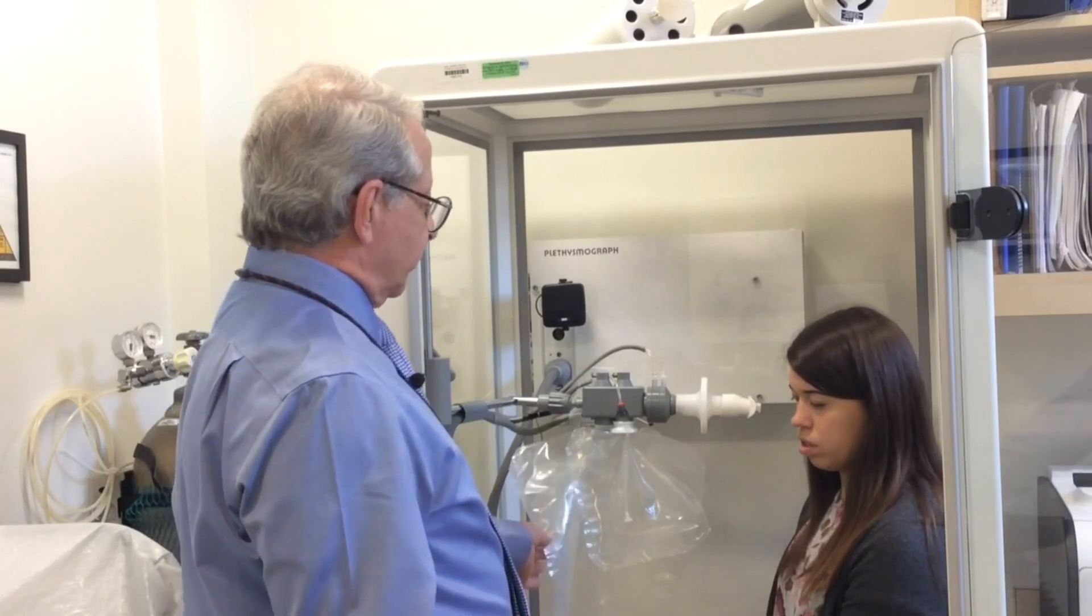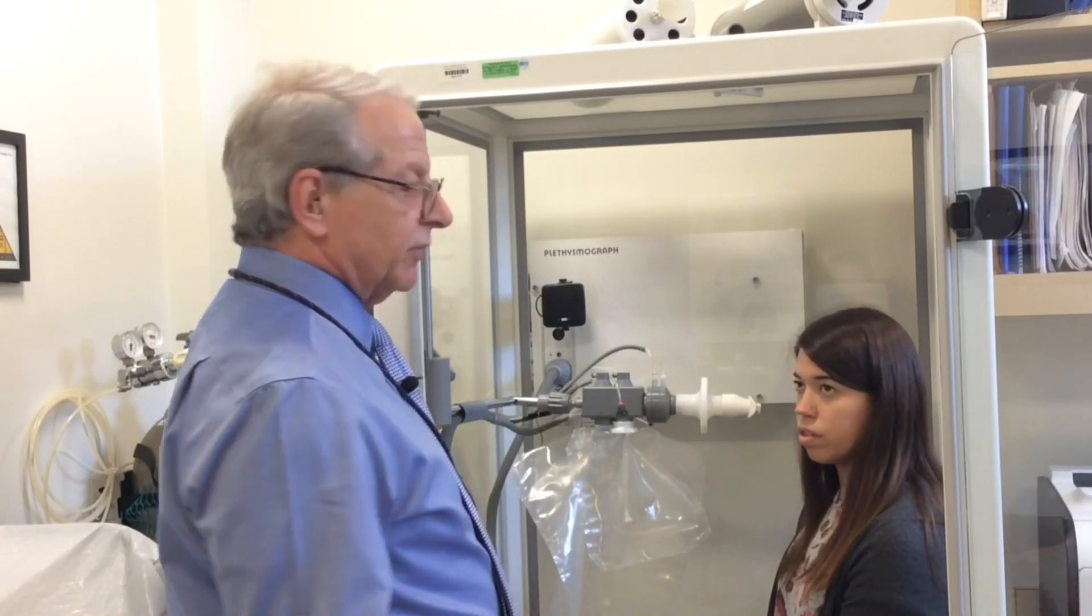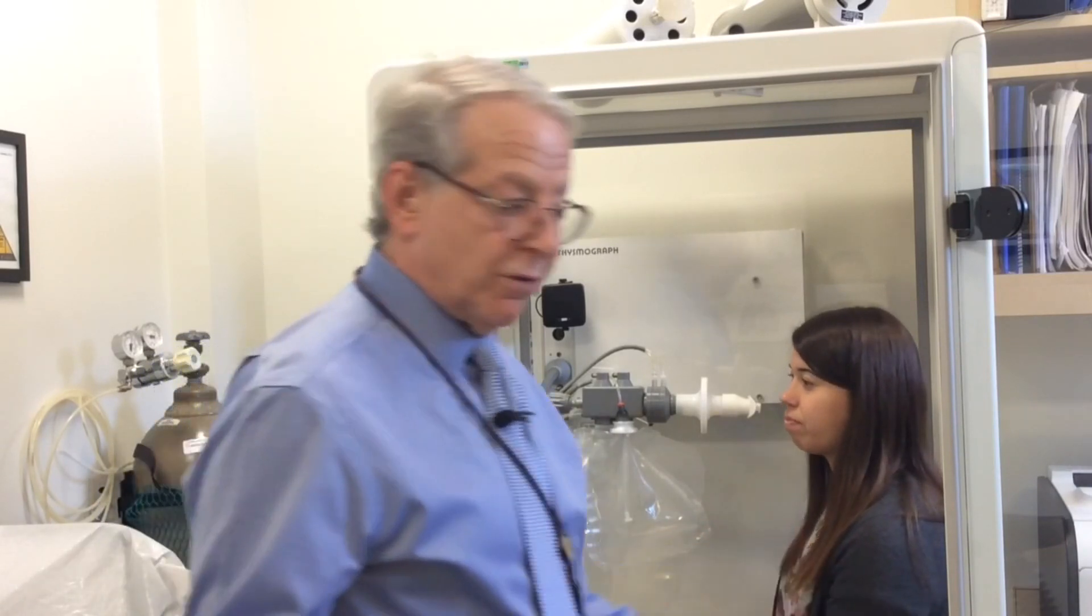This test is, once we get going with it, it takes longer to analyze than it does to actually do the test. Okay, so now I'm ready. I'll just go over here.